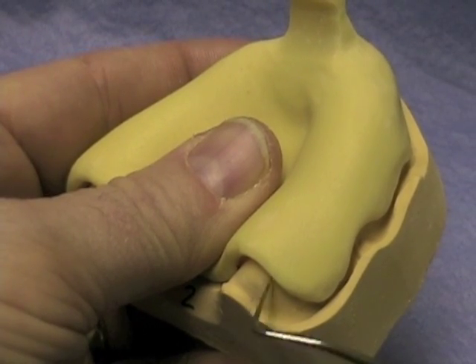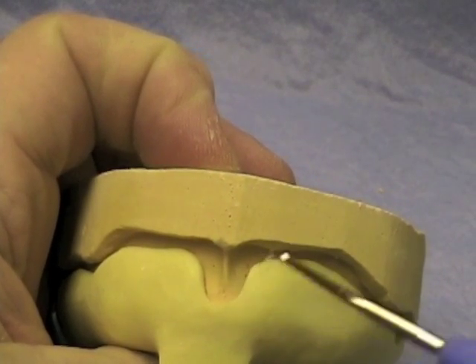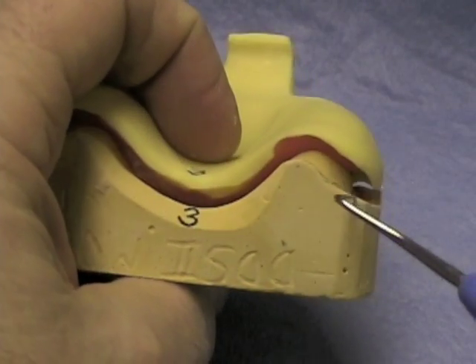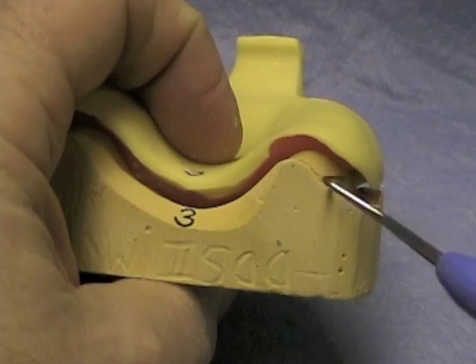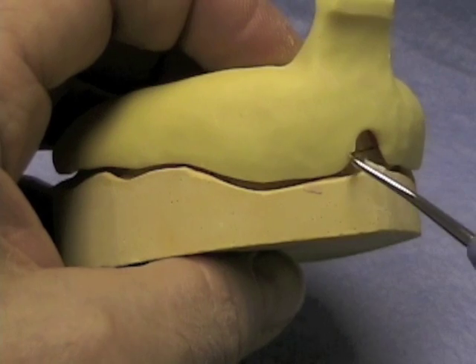This tray is too short of the hamular notches, and the frenal area is a little bit wide. Too much space has been used on this tray — you can see how far away the tray is from the tissue. You might as well use a stock tray if your custom tray is going to be that far away from the tissue.